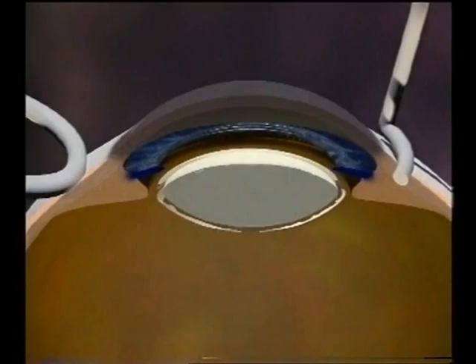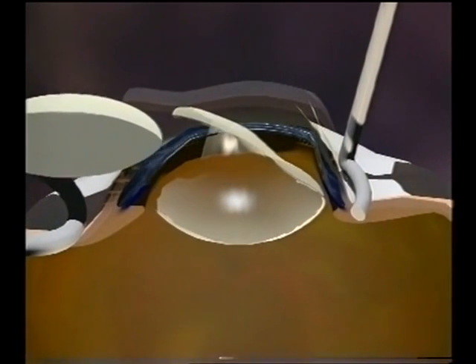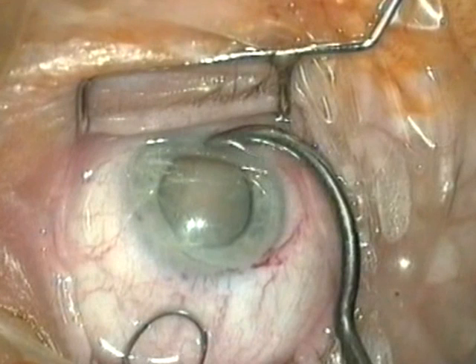An expressor and a vectis loop can be used to express the nucleus as shown in this diagram. The lens expressor presses at the lower limbus and the lens loop also presses about three millimetres above the incision. In this way the nucleus is squeezed out of the eye. Note carefully the positions of the expressor and the loop — in this case the tip of the expressor is pressing at the lower limbus.